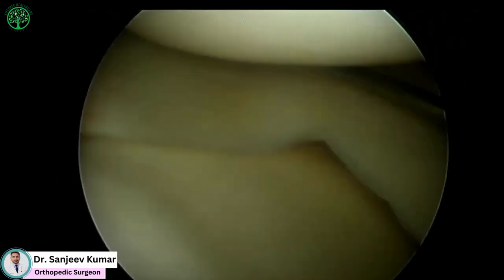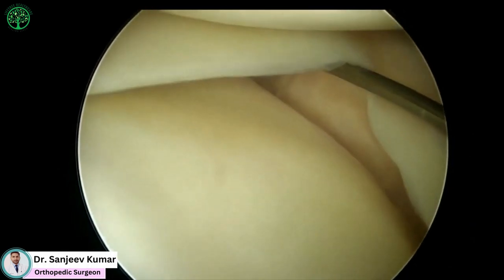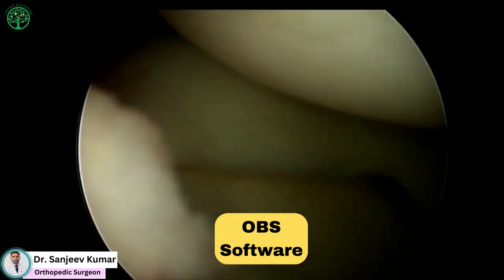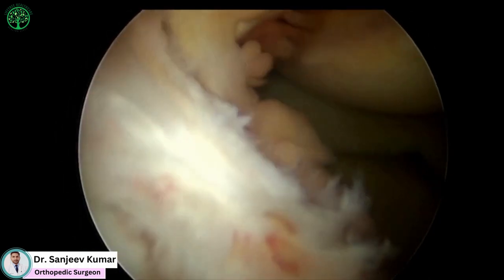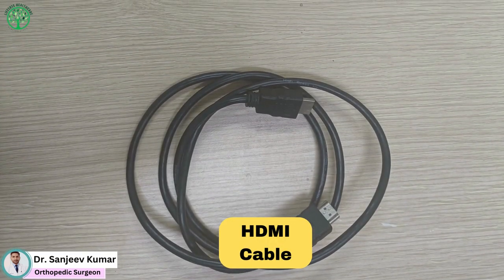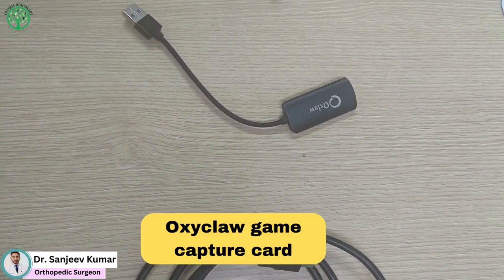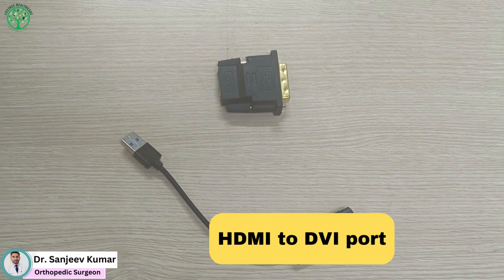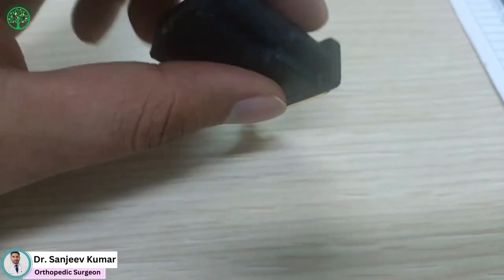If you want to record your scope videos and don't want to invest in any recorder, you can do it using your laptop. For this, you need to download OBS software, which is available for free. The hardware that you need is an HDMI cable, a game capture card, a DVI-to-HDMI converter, and an HDMI female to DVI male converter.